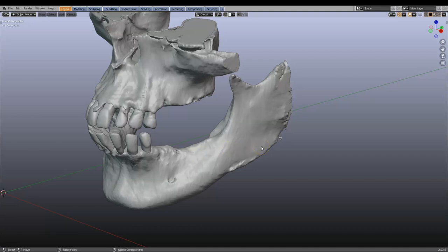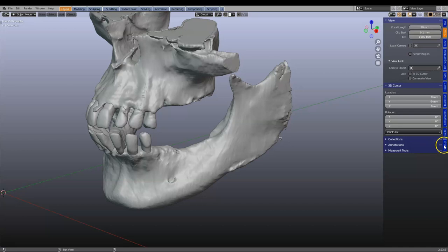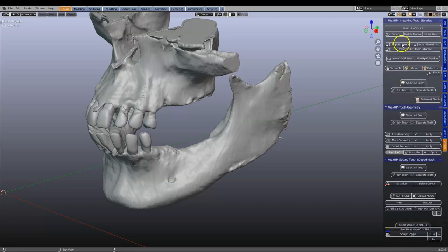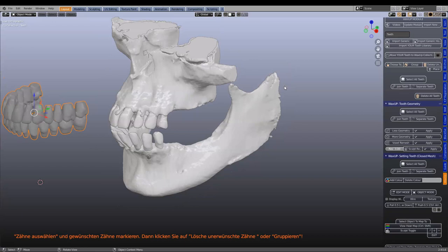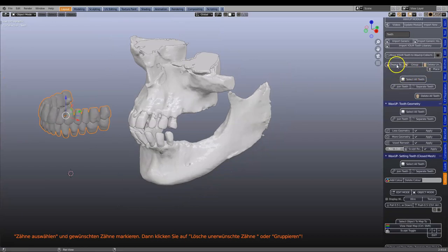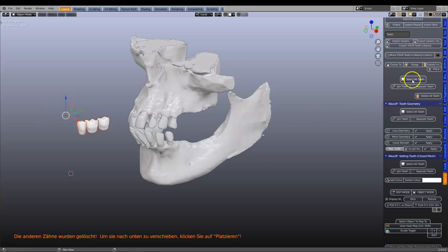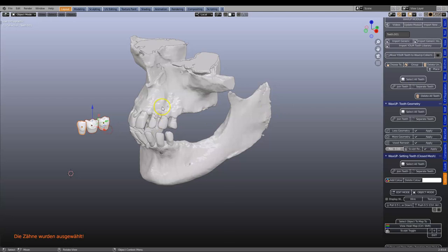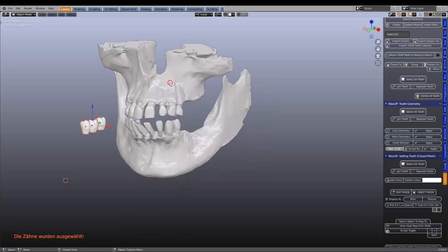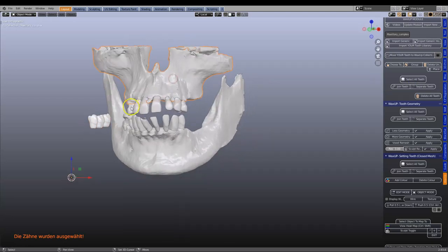The first thing I want to do is put some teeth in. So in the WaxUp module I'm going to import the generic tooth library and we're going to choose a few teeth — from here to there — and put them into position. All of the upper teeth I don't need at this stage, so I'll just hide them in a different collection for now.